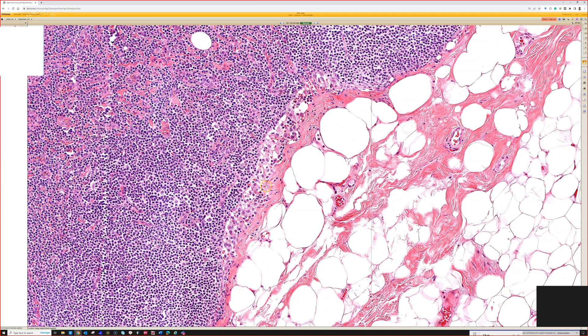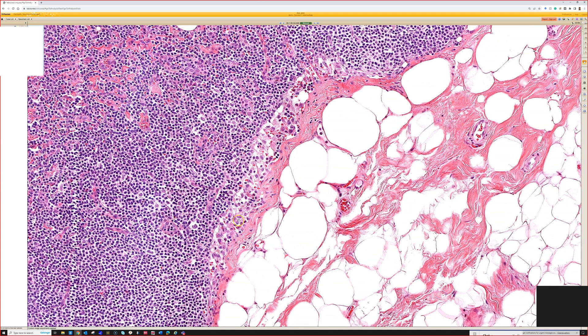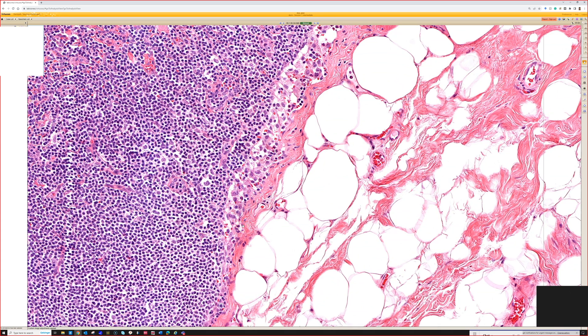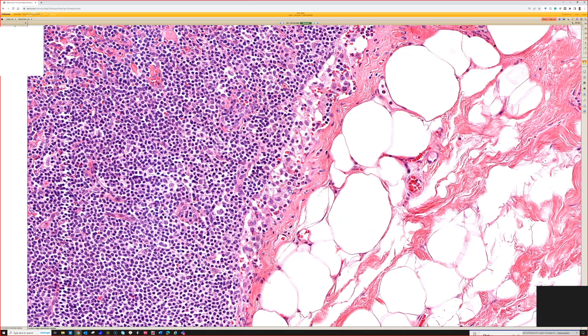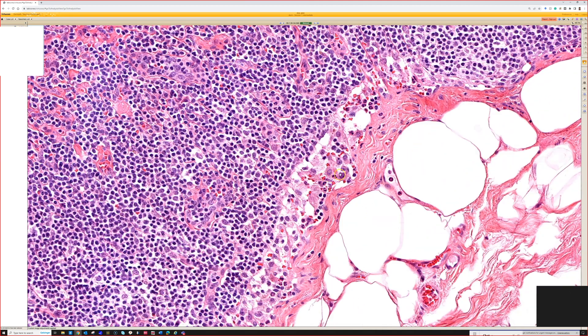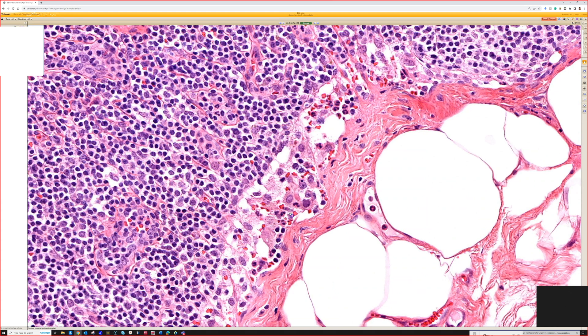This is sinus histiocytosis. You get pockets and clusters of histiocytes that fill up the subcapsular sinus and the sinusoids going down into the lymph node. In reactive lymph nodes it's a common benign finding. I remember as a first-year pathology resident, these would constantly catch my eye and I would go look and study them because I was worried about metastatic tumor.